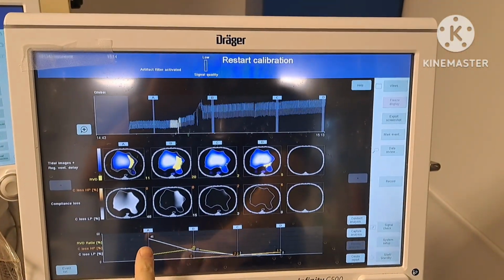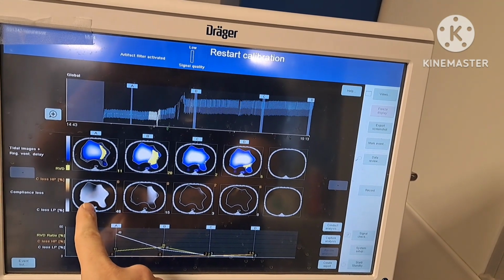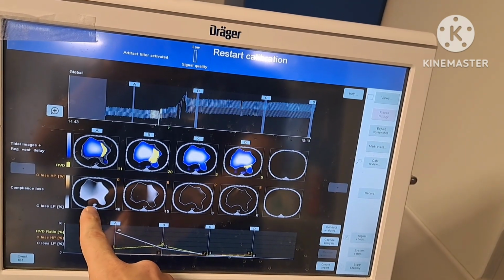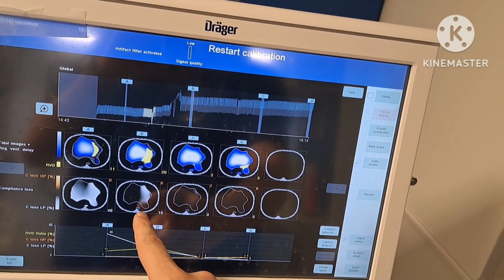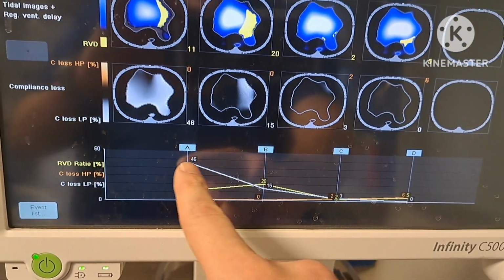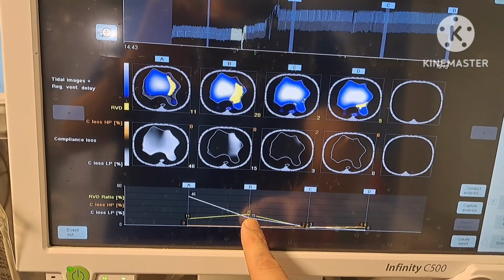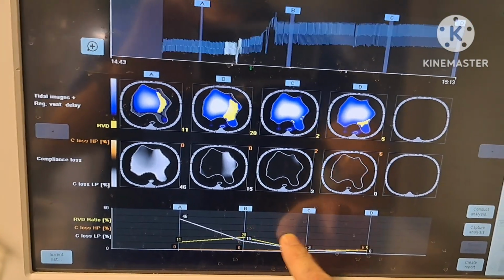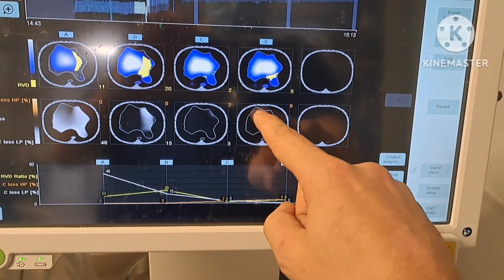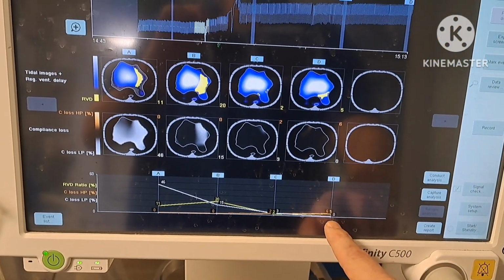Okay, again over here, this was the issue when we were on PEEP of 10 on pressure support. Well, it was PC-PSV, so it's kind of flow cycled AC PC. And then after here, we just started the APRV here. But already, look, it went down. There was a gain, a 30% improvement in compliance. And then after we left it there, just over time, look, we see now that the white is completely disappeared. There's a little hint of orange at 6%. We're going to keep it there for a little bit longer.